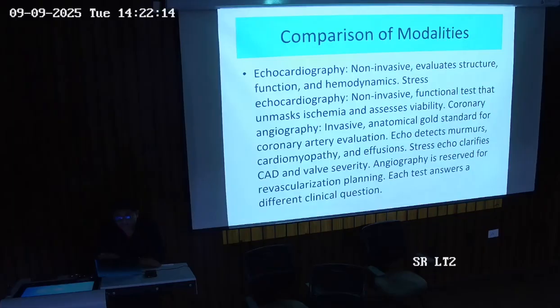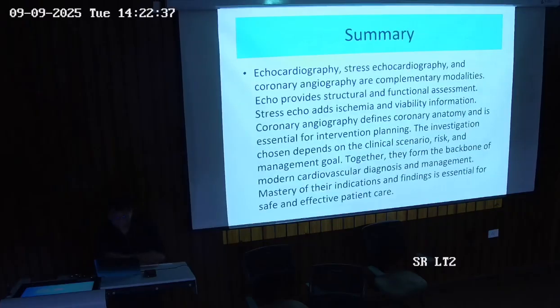Each test answers a different clinical question, so each modality has a different superiority. We cannot say echocardiography is of lesser importance than stress echo or angiography. Each is equally important according to the disease we have. So in summary, echocardiography, stress echo and coronary angiography are complementary modalities to each other rather than single.